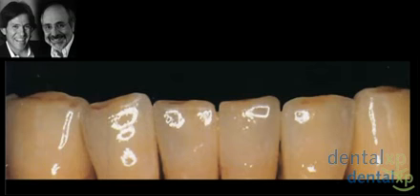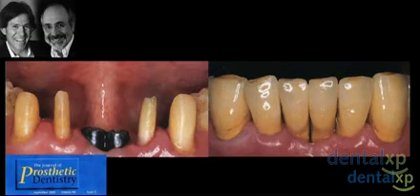This looks like a pretty successful case when you evaluate it. So the first one is an attempt to be really pretty. They've characterized it pretty effectively. But if you really start to look at the crucial interfaces, and you go back, just look at what this looks like. So we have osseointegration, we have a functional restoration, we have pretty ceramics. It's actually on the cover of the Journal of Prosthetic Dentistry.